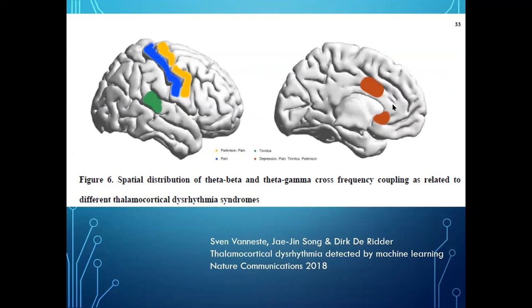So I'd like to focus on this as what we're looking at for our next piece, because depression is something that has TMS and, to a certain extent, also tDCS being used clinically. And when we can identify depressed people blindly at better than 80% accuracy, the rest of these were over 90% accurate. The depression is probably not as accurate because of the DSM. It's not a homogeneous pattern. And again, the computer system, artificial intelligence, machine learning algorithm found this location.